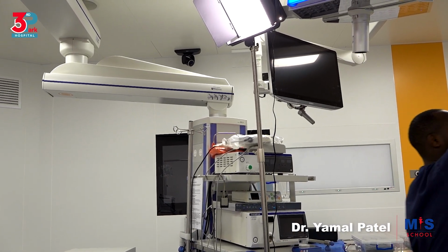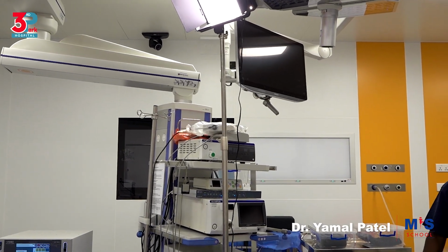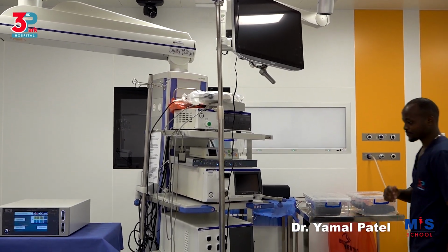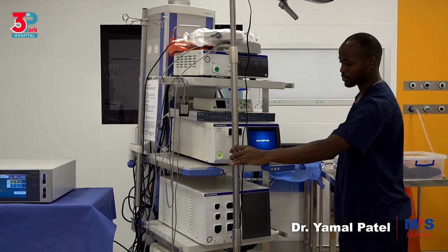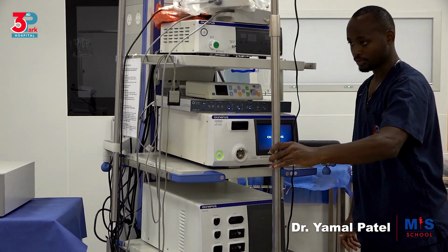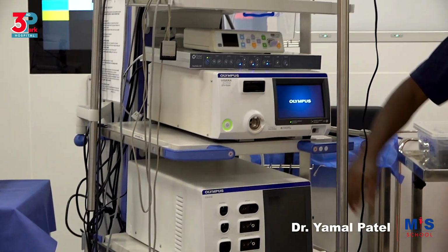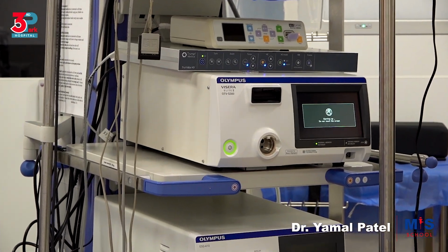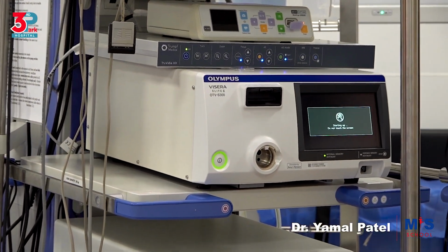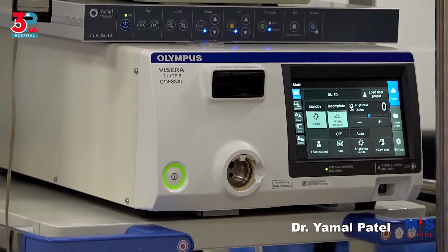Then the equipment which will come in the hysteroscopy cart will be the camera processor. Attached to it will be the camera. We have a light source. In this one it is the same equipment. In other towers you can have the camera source, the camera processor and the light source separately.